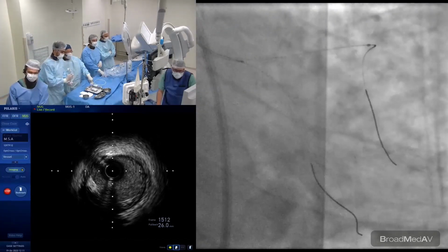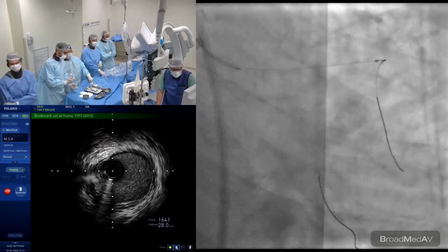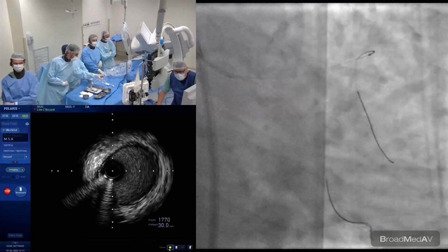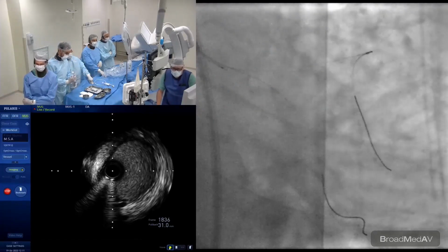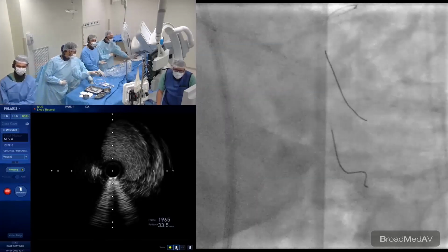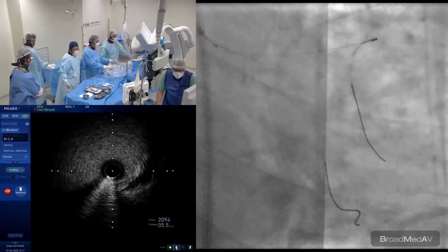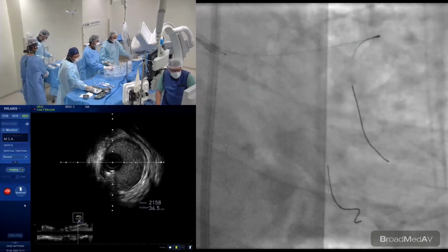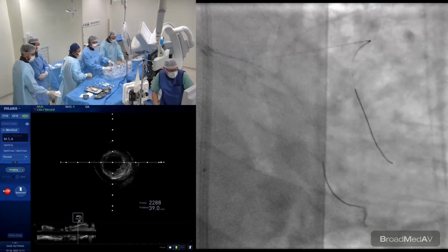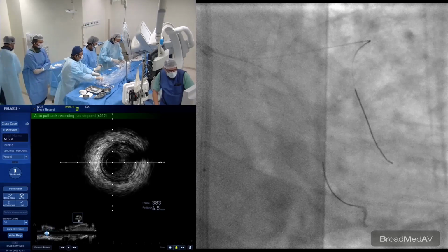And diffusely diseased, the left main is, you're right, about 4.5. Yes. There's some diffuse disease here. And as we come proximal to the very ostium, we don't see disease anymore. So I think that's a bit of a challenge here to find the right landing zone because it's diffuse disease into the LAD. Are you going to do the circ too? We're going to do the circ as well now, just to see how much involvement of disease we have in the ostium. Exactly.